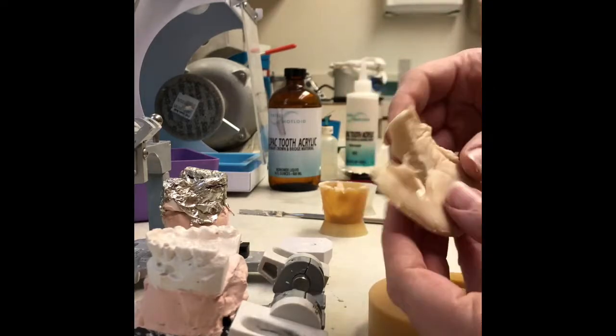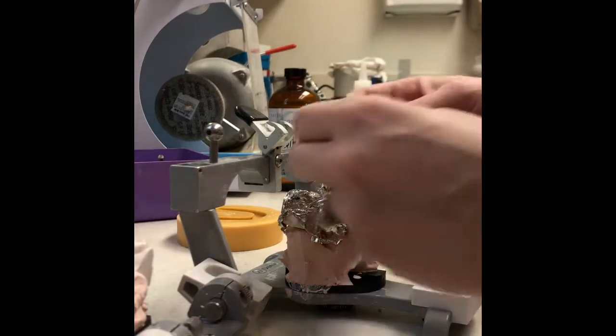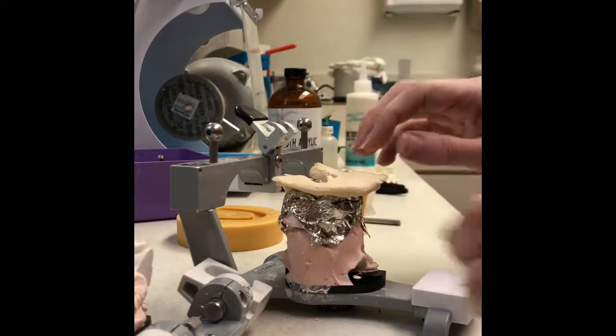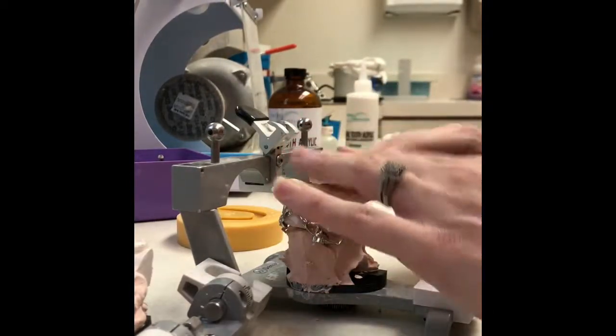Peel that out, and it's taking the shape nice and long on the lingual, so we have plenty of room to work with. And we're going to mold this to our cast here. So put it right over the top of the cast there, and then I'm going to work it to cover first the lower teeth. We want it to be nice and flat on the top.